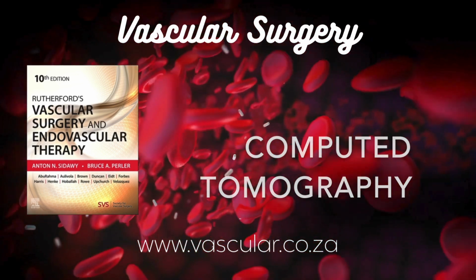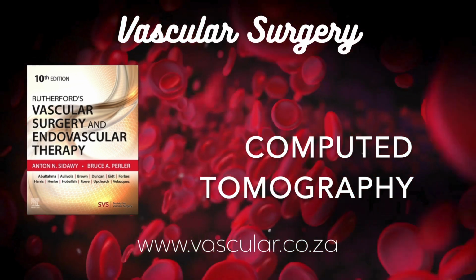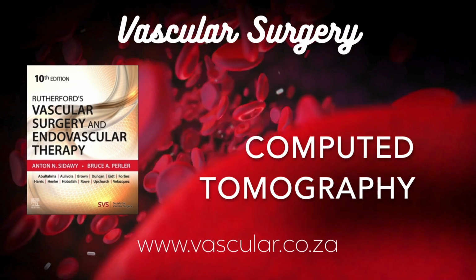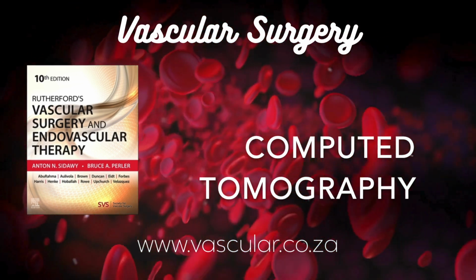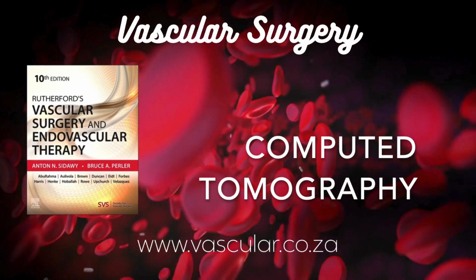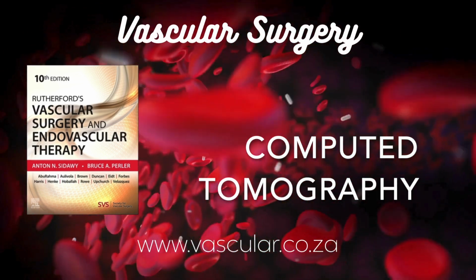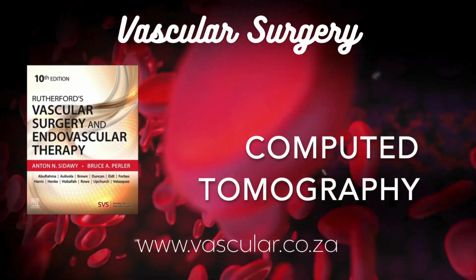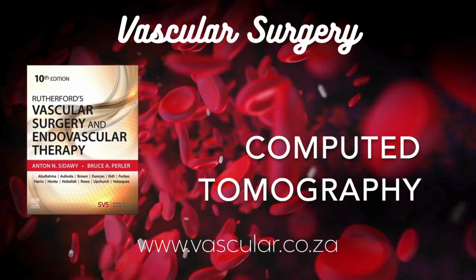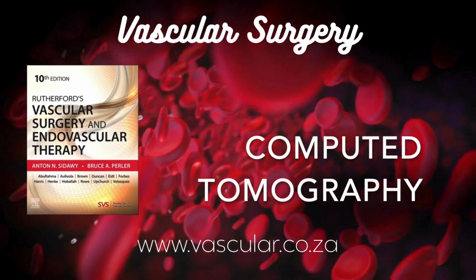What about scanning time limits and patient positioning? Older scanners used to have limits on how long the tube could run continuously before overheating, maybe 20 seconds or so. Modern scanners can typically go much longer, maybe 100 seconds or more if needed. Positioning is key, too. Getting the patient centered in the gantry is important for image quality. And the arms up thing? Yeah, for chest and sometimes abdomen scans, having the patient raise their arms above their head gets them out of the way, preventing artifacts called beam hardening that can streak across the image. Right. And contrast protocols, we covered that: timing, volume, rate, all tailored.